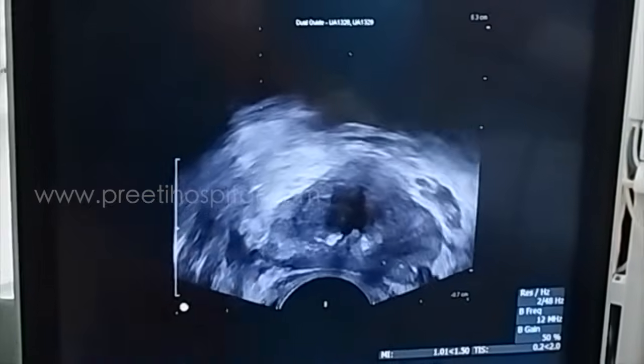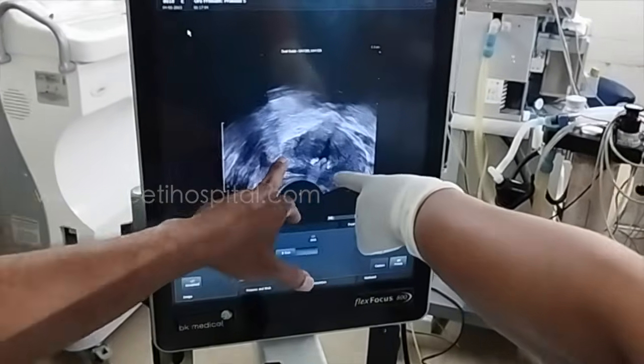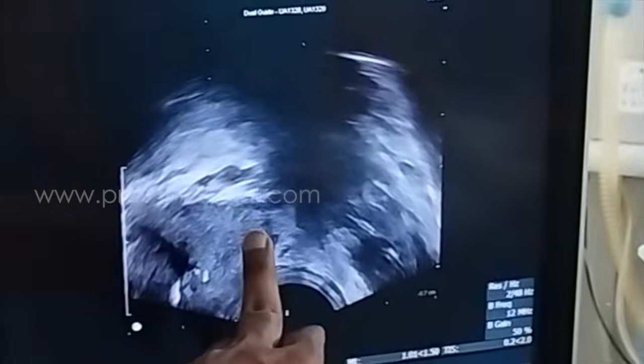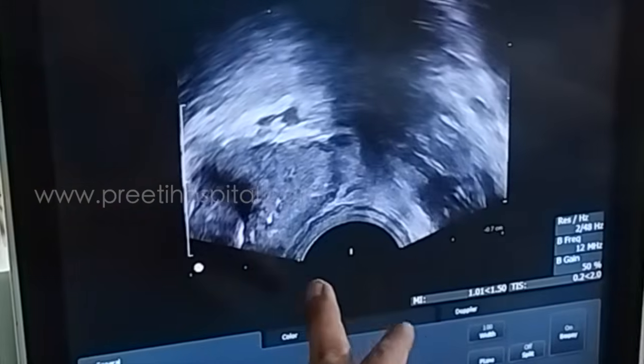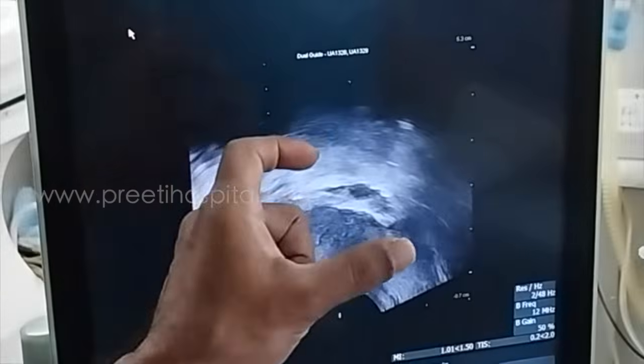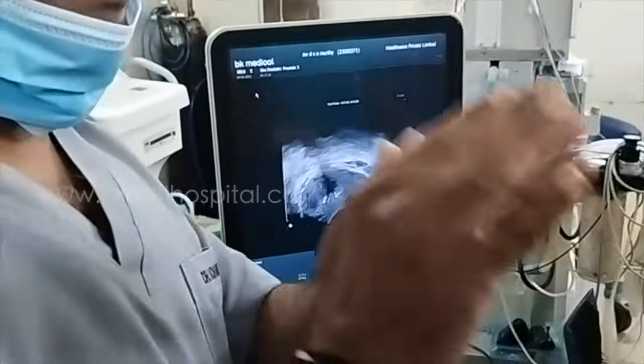Now this I am doing down, this means this is the left. So in axial, if you move up and down, this is the right. So in axial, it will be opposite, whereas in the transverse, it is the same. So transverse and sagittal are one. Axial is one.